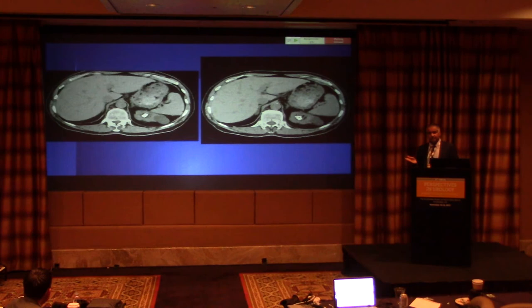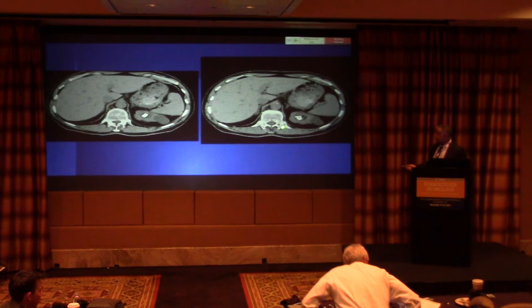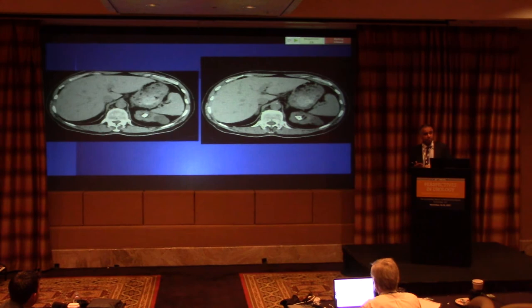These are the views that are most important to look at in planning your percutaneous access. It allows you to look at the liver, the spleen, the bowel. In this situation, there's a pleural reflection that I might be worried about. This might be the type of patient where we don't do an upper pole puncture, we adjust our plans. This would be a patient with what type of abnormality?